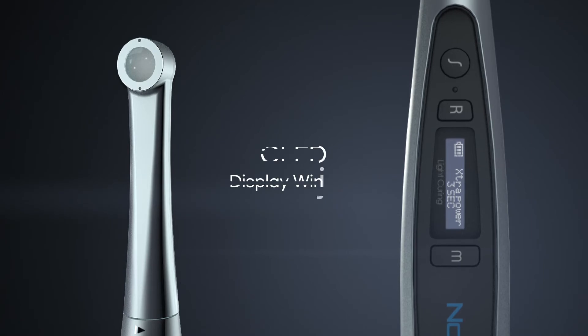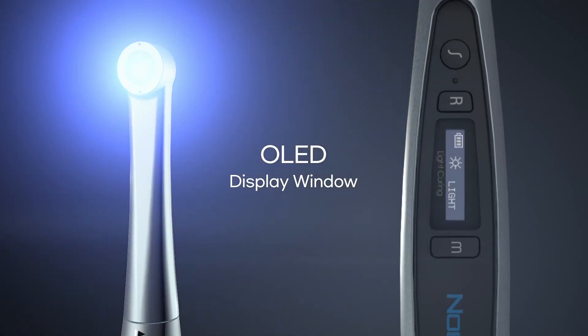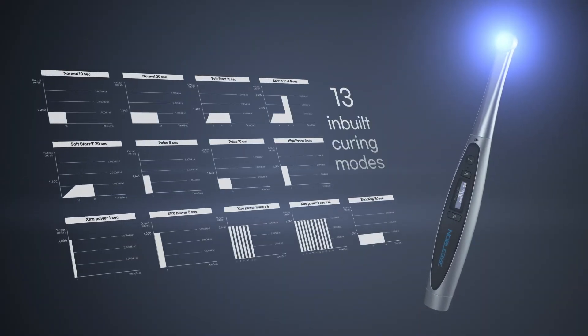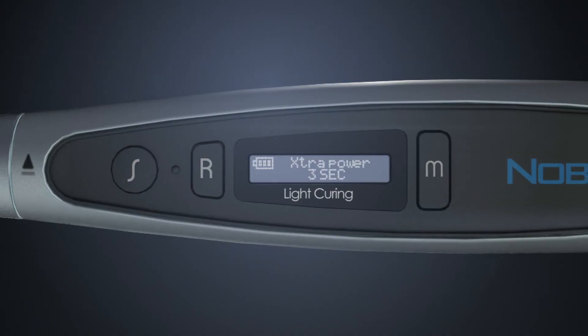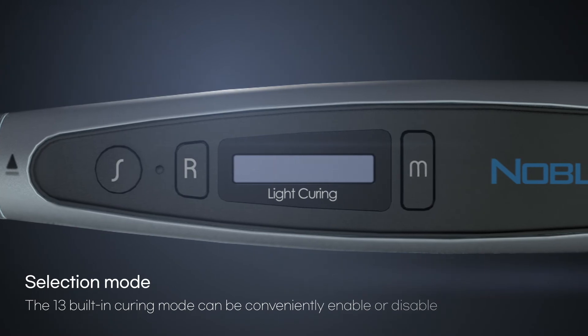You can select any curing mode you need through the OLED display window. The user interface is improved with intuitively designed buttons and 13 built-in curing modes. The 13 built-in curing modes can be enabled or disabled conveniently through selection mode.